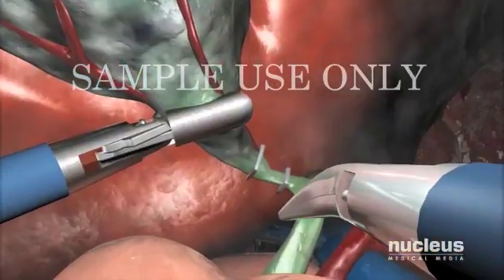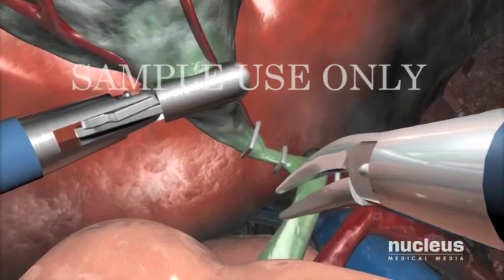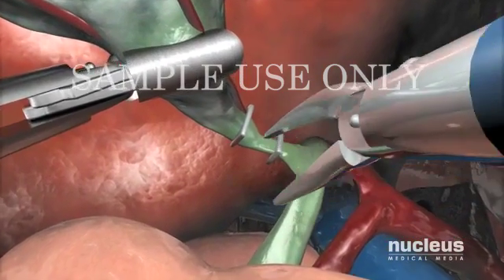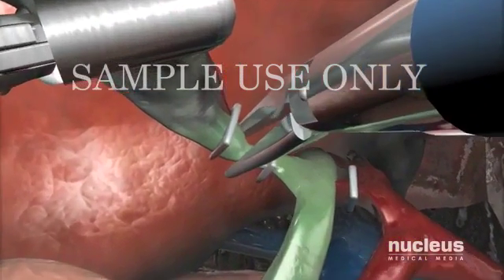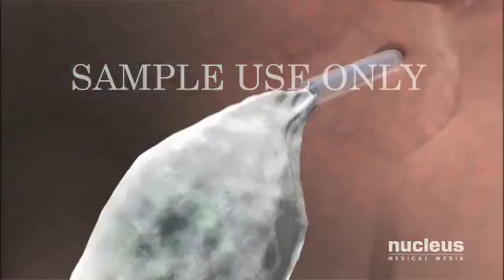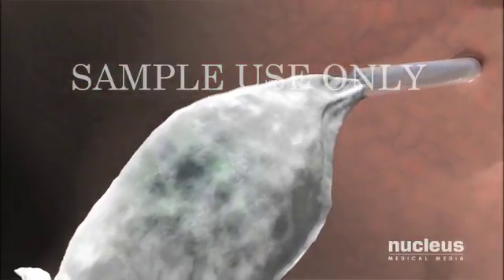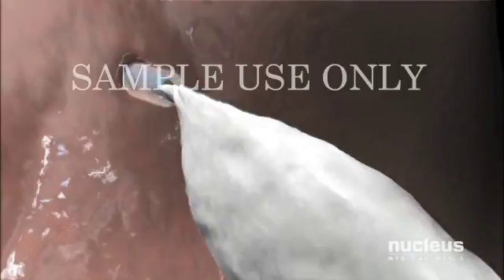Using other instruments passed through the various ports, your surgeon will grasp the gallbladder, clip off its main artery and duct, drop it into a specimen bag, and remove it through one of the ports.